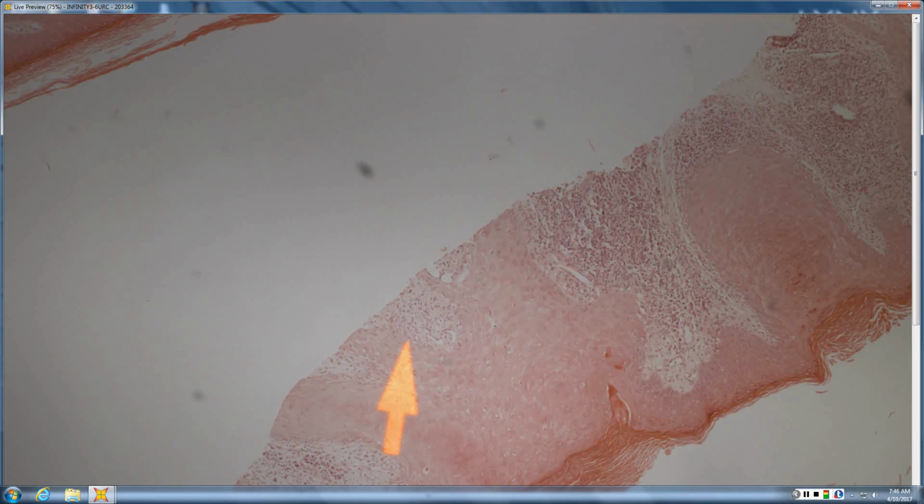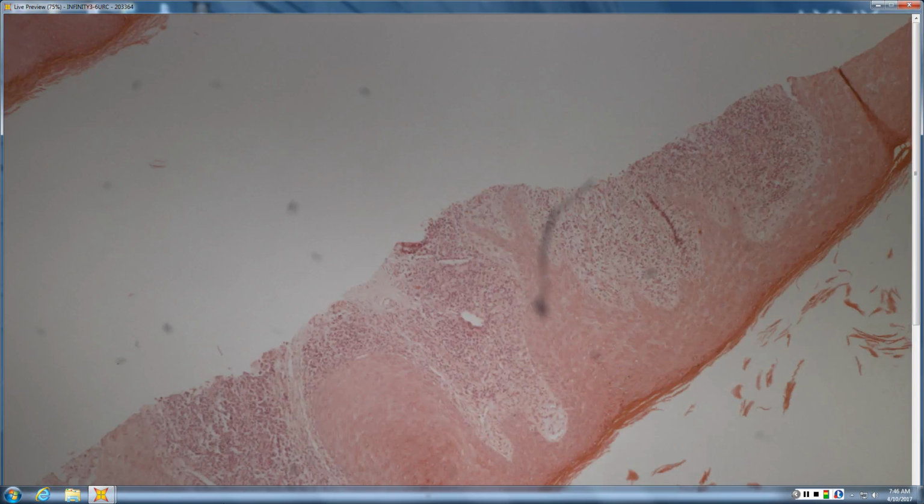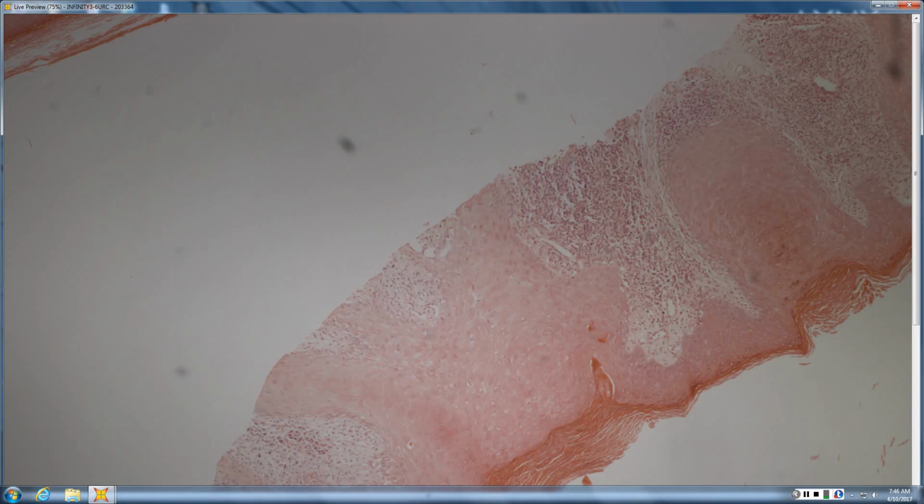Lichen planus, lichenoid drug, lichenoid GVH, lichenoid regression of melanoma, acral lupus. So which ones tend to have PEH like this? PEH of the follicle. Give me 2 out of that list of lichenoid things that tend to have PEH of the follicle. Anyone want to jump in? Hypertrophic LP and lupus. Those are the 2.